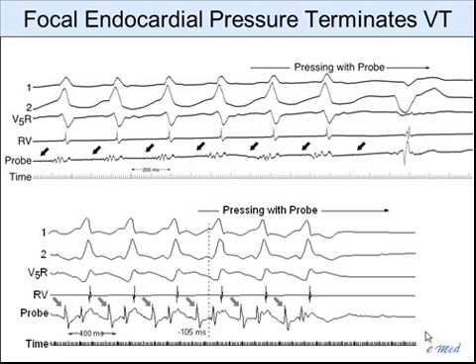Now, I can't help but go back to my roots at the University of Pennsylvania in intraoperative mapping. This is one of the last cases I did. This is probably almost 20 years ago now. We've supplanted this so much with catheter ablation. But this is an intraoperative map of a guy in whom we used to play around with this. I'd ask the surgeon to move the probe around and then say, okay, this looks like a good spot. Press here, and you see the tachycardia terminates.